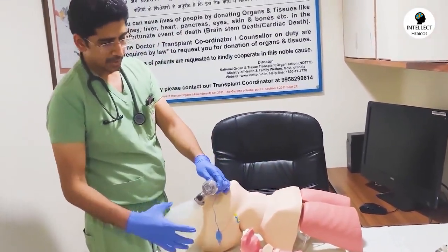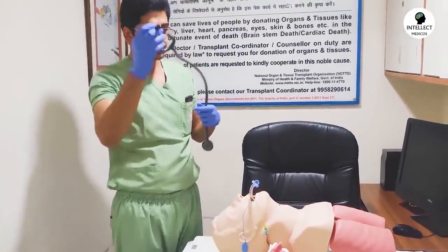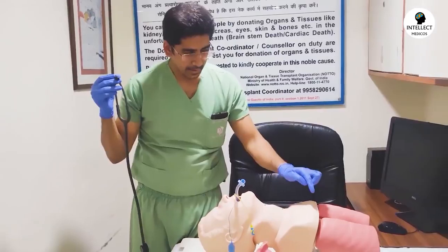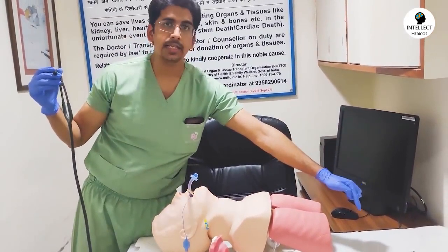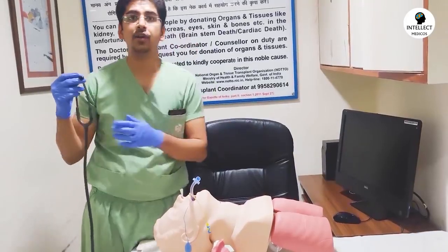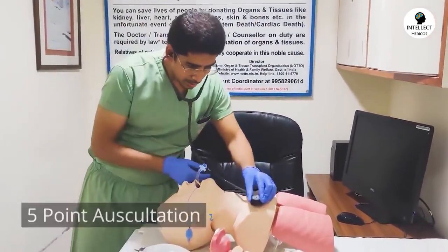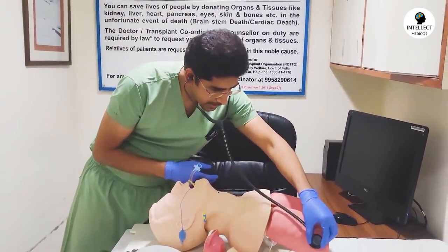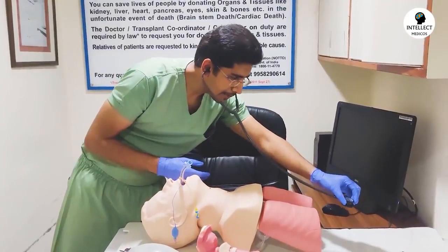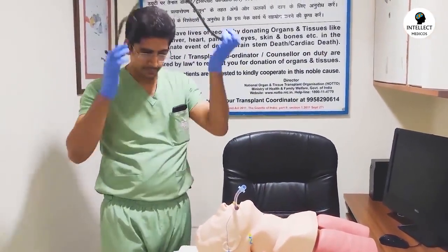Now, after intubating, the important step is I will auscultate the two apices, two bases, and then the epigastrium. That is called 5-point auscultation. So, two over here, two at the bases, and one at the epigastrium. So this is called 5-point auscultation.